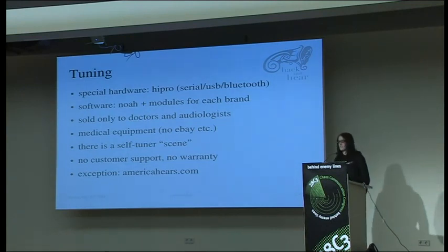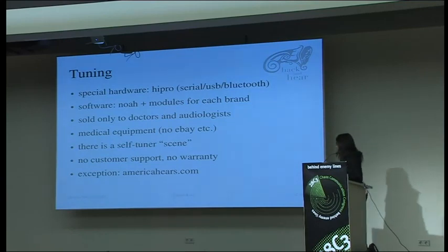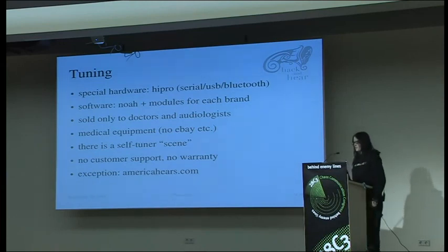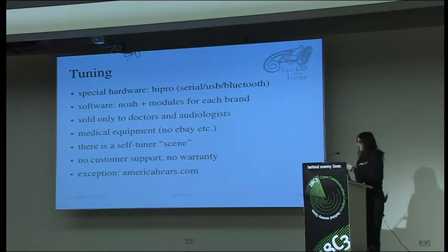Of course, then you have no customer support, and when you fry your ears or your hearing aids, it's your own fault. There's one exception in America. There's a hearing aid manufacturer called America Hears. They sell quite low budget hearing aids, up to $1,000, if I'm right. You send in an audiogram of yours and they tune it at their place for the first time. And then you can download the software and tune it a little bit more at home.